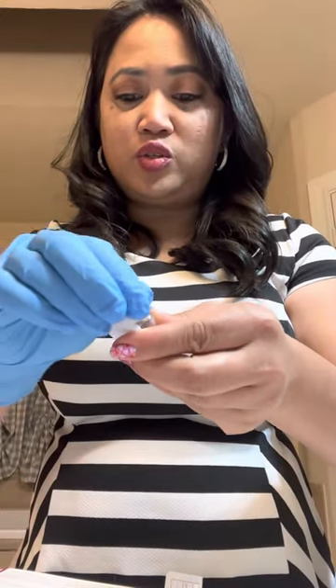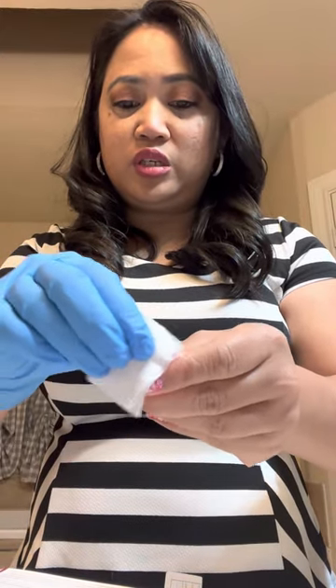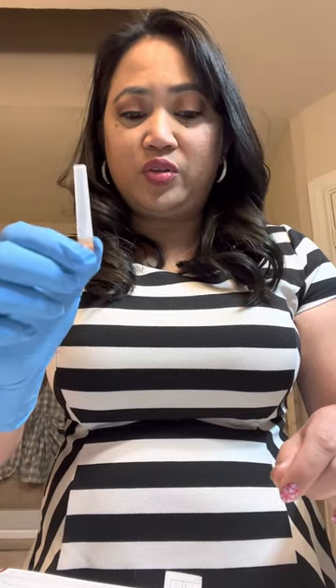Use alcohol pads to clean the area. You're going to have the glass ampules that have the solution, and then you're going to have the powder, and then a 3ml or 3cc syringe. I'm using 25 gauge to inject — some people do 30 gauge, but I like 25 gauge better. I feel like when you're pushing the meds it doesn't burn as much compared to when you're using the 30 gauge.